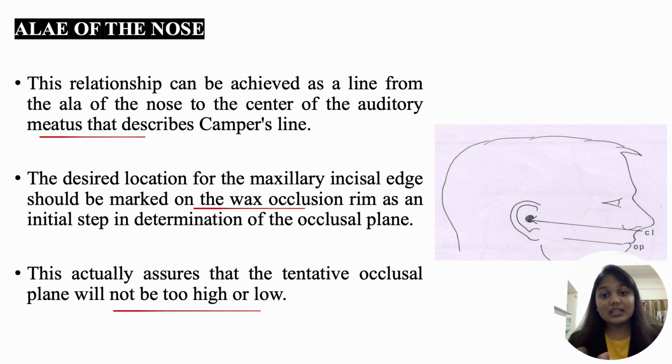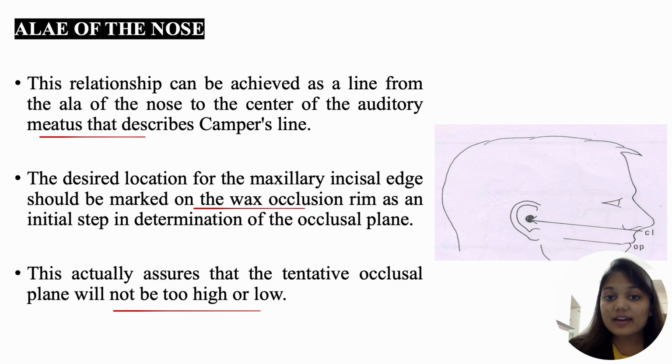So now with this we have seen the reference points, that is the anterior reference point and the posterior reference point. The anterior reference points are the orbitale, the nasion minus 23 mm, and the ala of the nose. Now while we record and transfer, these anterior reference points have to be taken into consideration as well as the posterior reference points. Now what are the posterior reference points? What we have studied are the Bergstrom, Beyron points and the Gysi point.